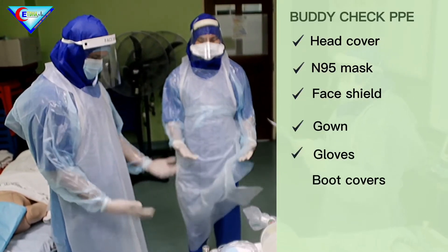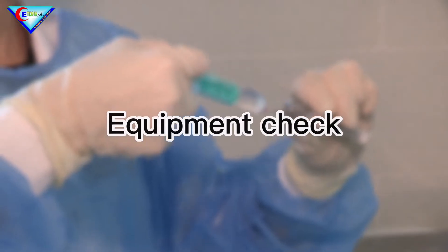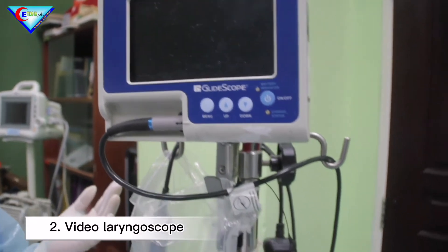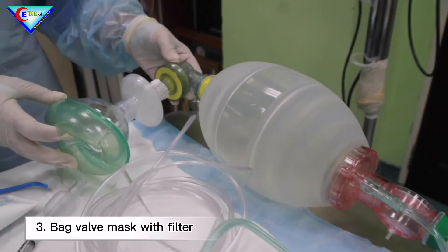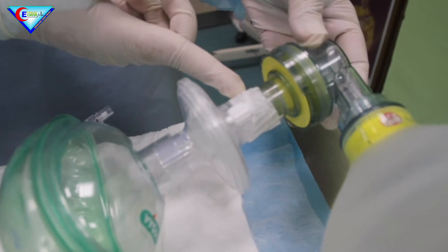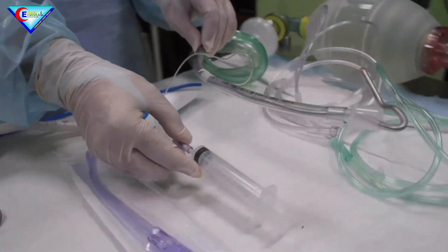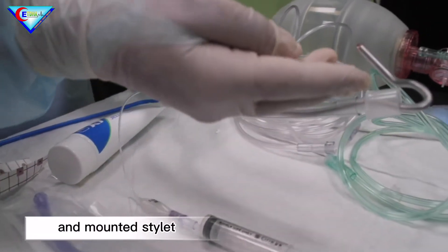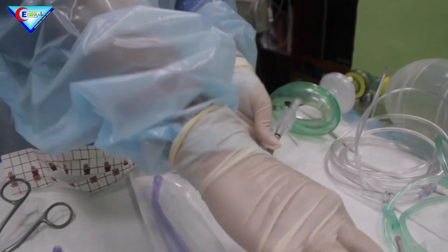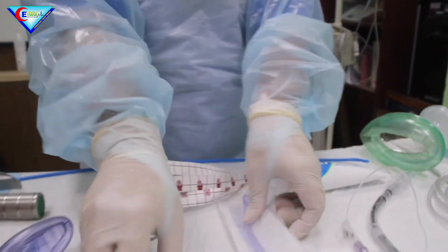Check. Check and appraise. Check. Intubation box: video laryngoscope. Prepare bag valve mask, ensure there is a bacterial filter and also sealed joints. Nasal cannula. ETT with attached syringe and mounted stylet. Ensure the balloon is properly functioning. Prepare lubrication. Suction if necessary.